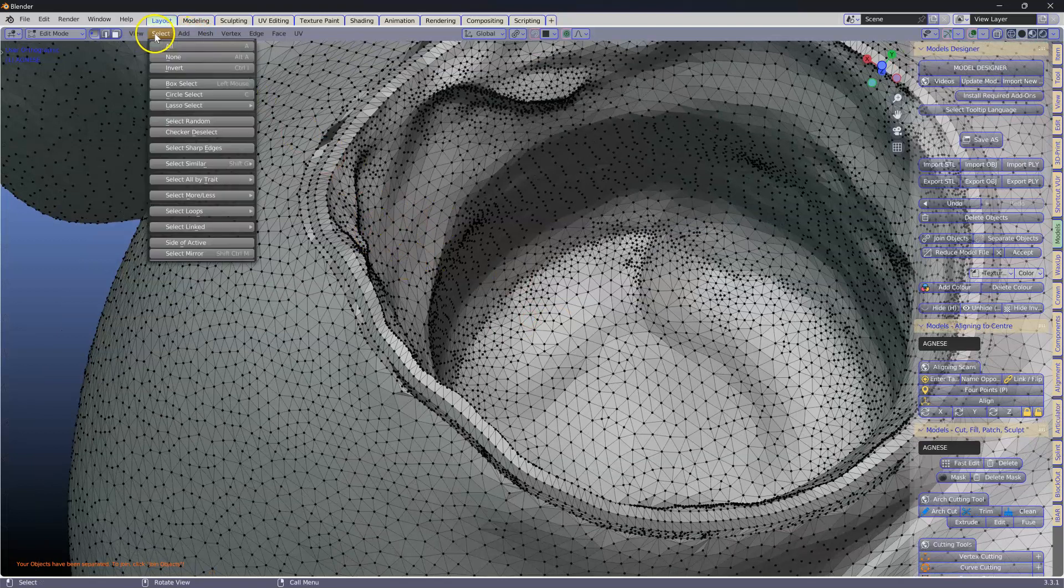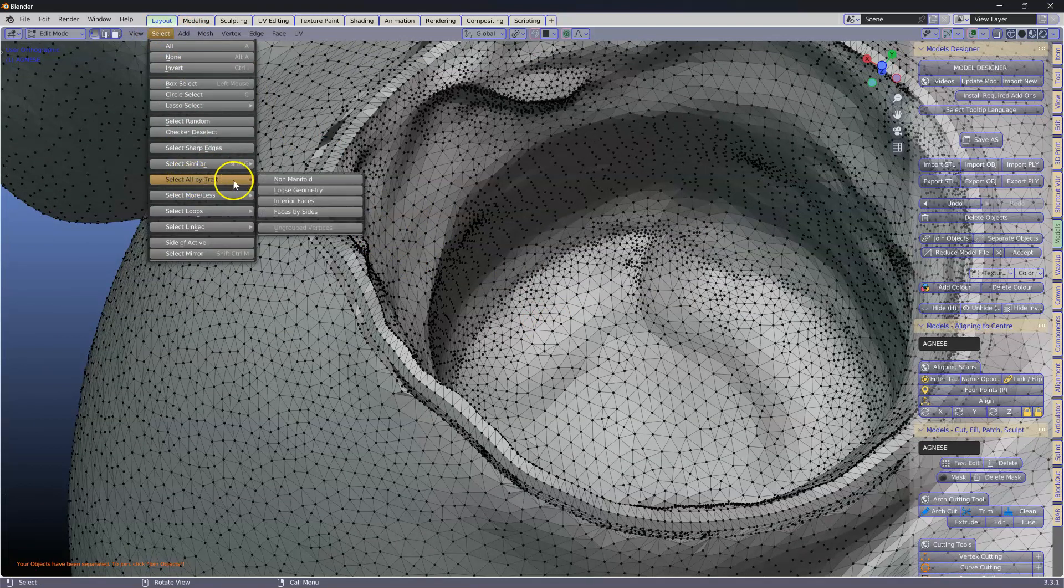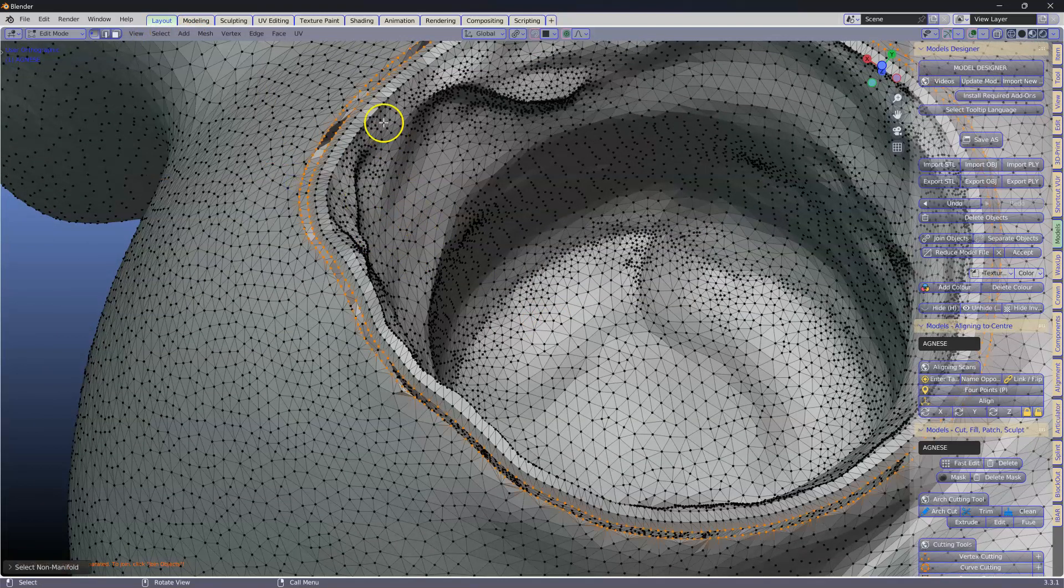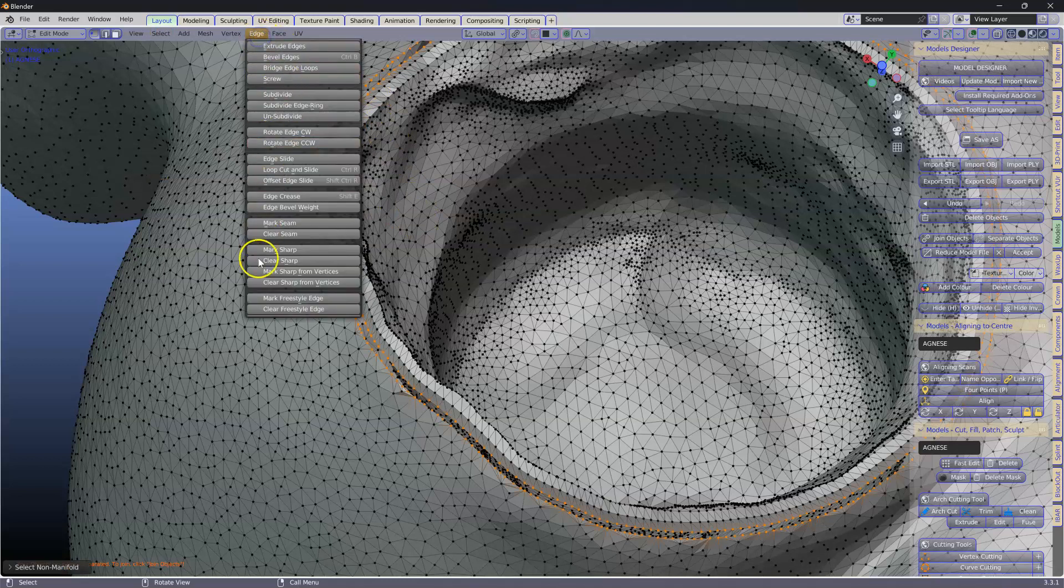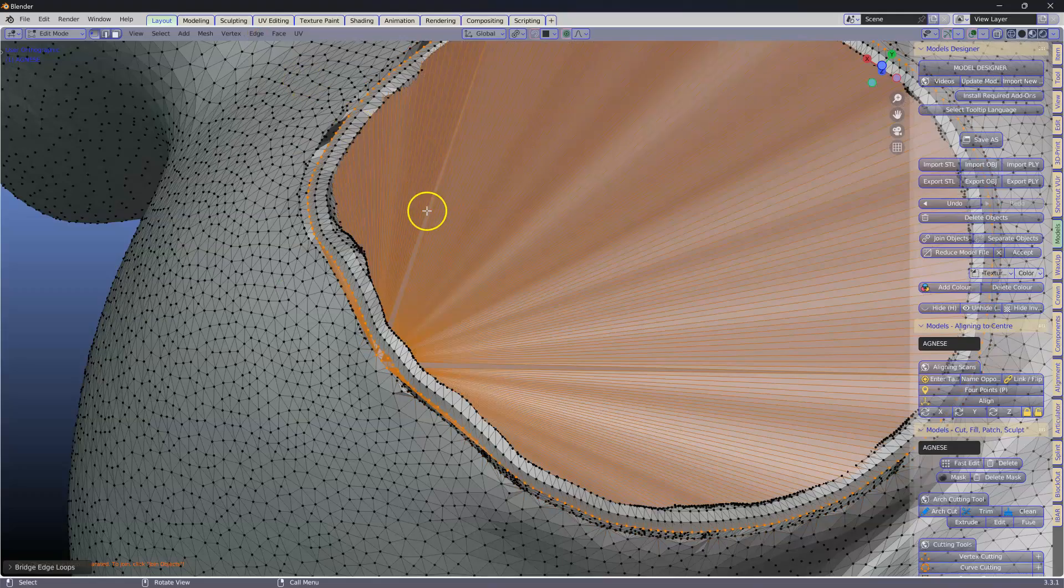Select all by trait, non-manifold. Go to edges. Bridge edge loops. Now we see this has failed.